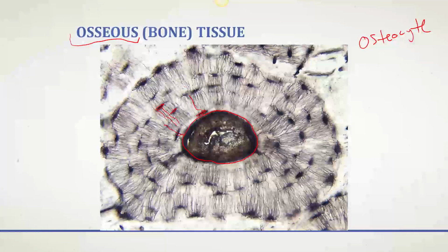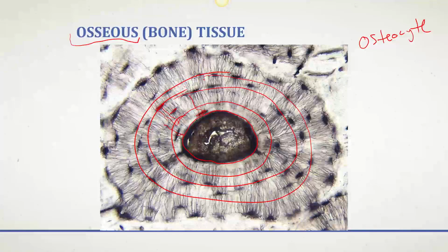We're going to learn more about the structure of the osteon, what every single one of these little parts is in the osteon, but we're going to keep it pretty basic for osseous tissue. So for features, to me, it kind of looks like rings on a tree. If you look at here, you can see ring-like structures, like growth rings on a tree. For location, it's located in your bones. And function, mineral storage. So this stores calcium and phosphorus for us. And structural support, so it supports the body.